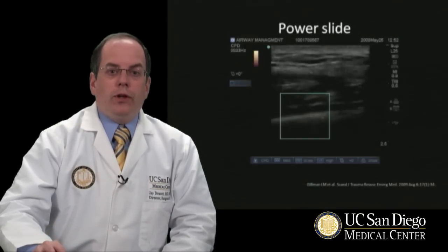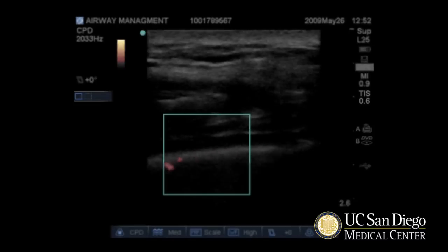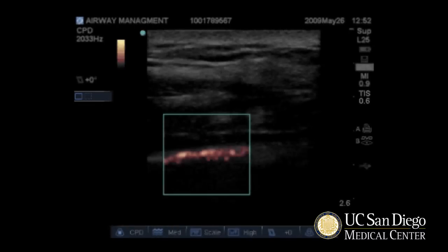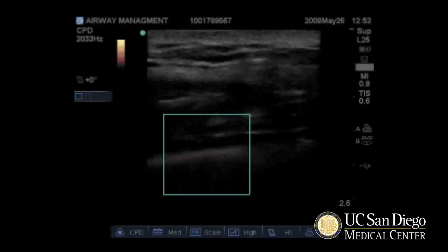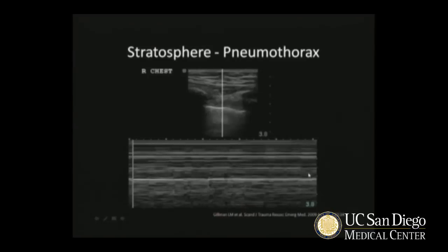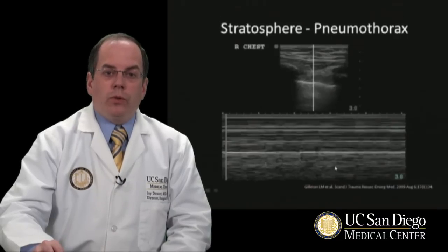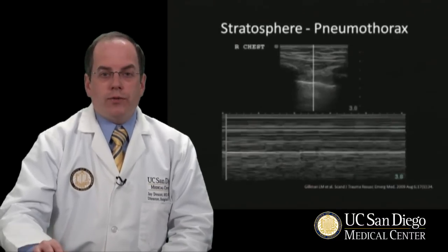The power mode can also be used to detect motion, as it's quite sensitive to motion in the selected field. In this case, you'll see that every time the patient takes a breath, something bright shows up in the far field. This is the lung sliding back and forth. This patient does not have a pneumothorax. If a pneumothorax is present, one thing that may be noticed is that the far field is quite indistinct and no motion is seen. If one puts the machine into M mode and looks at motion along the line, there is no distinctive granularity of the distant field — all appears to be about the same. This is called the stratosphere sign.